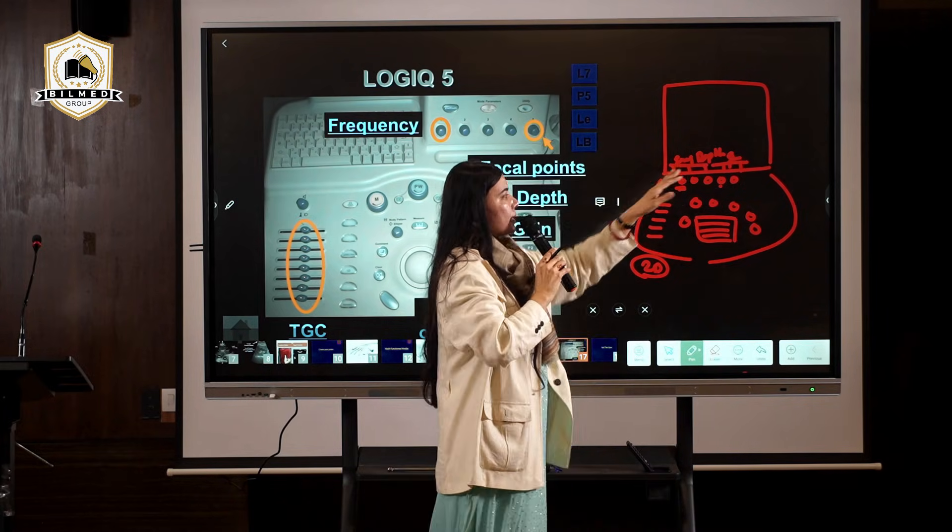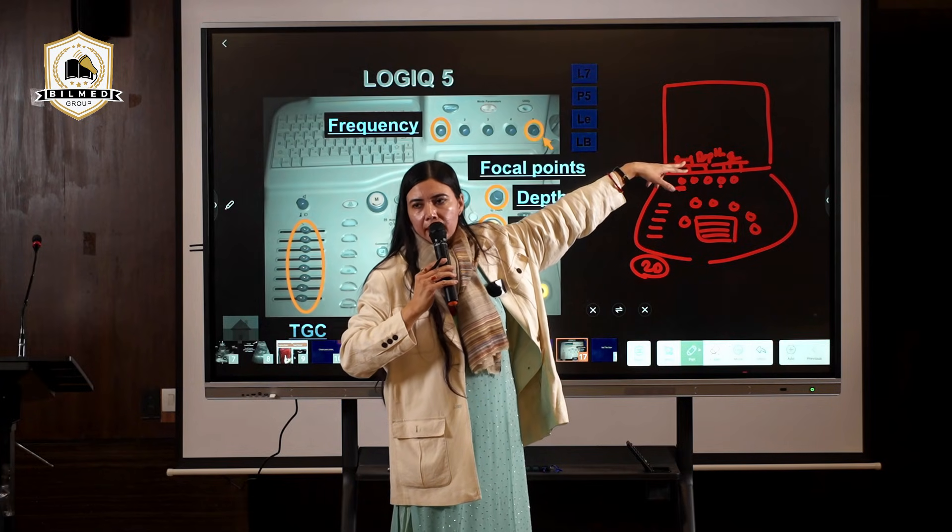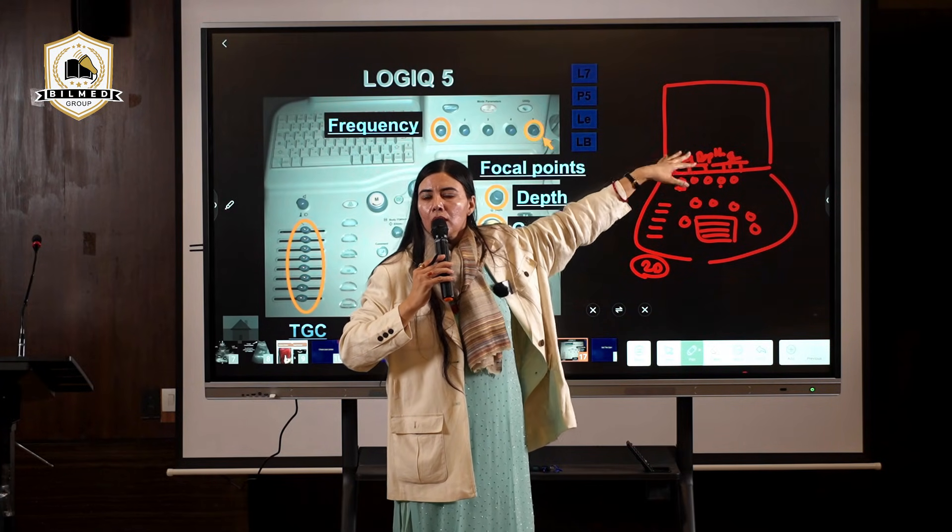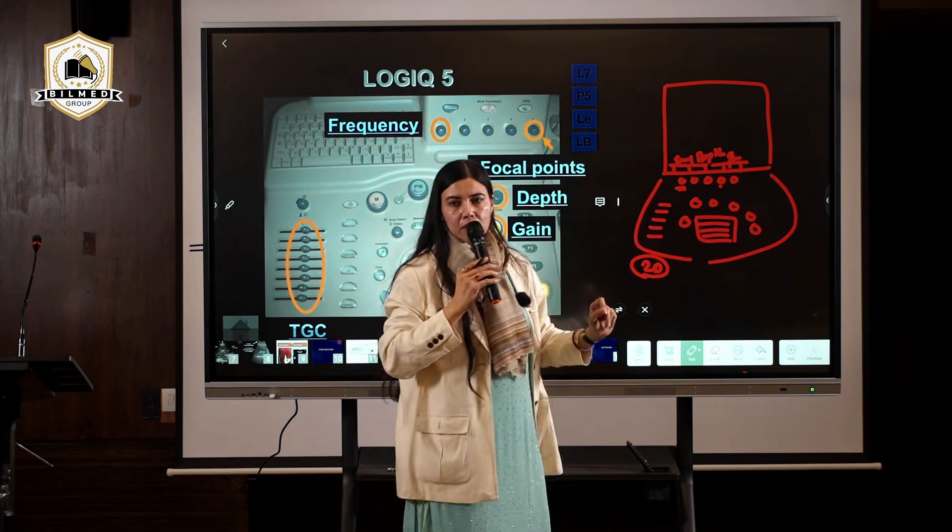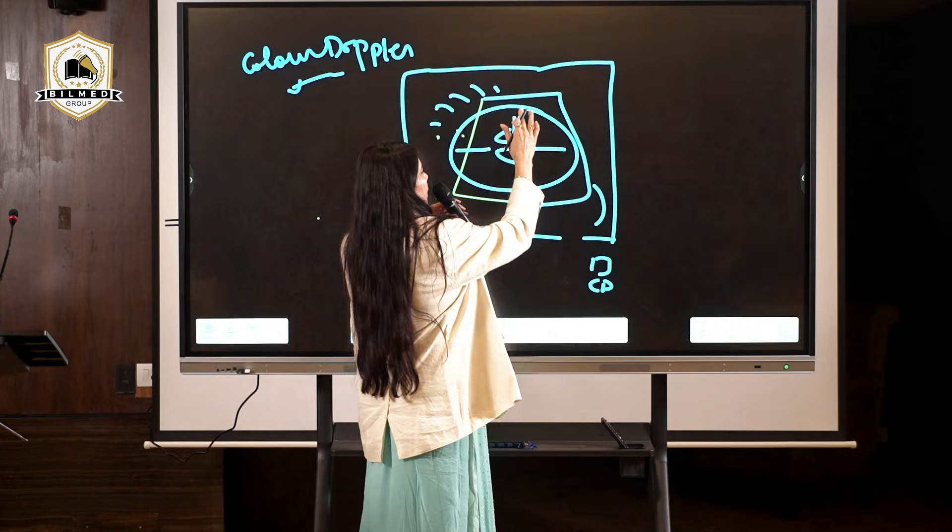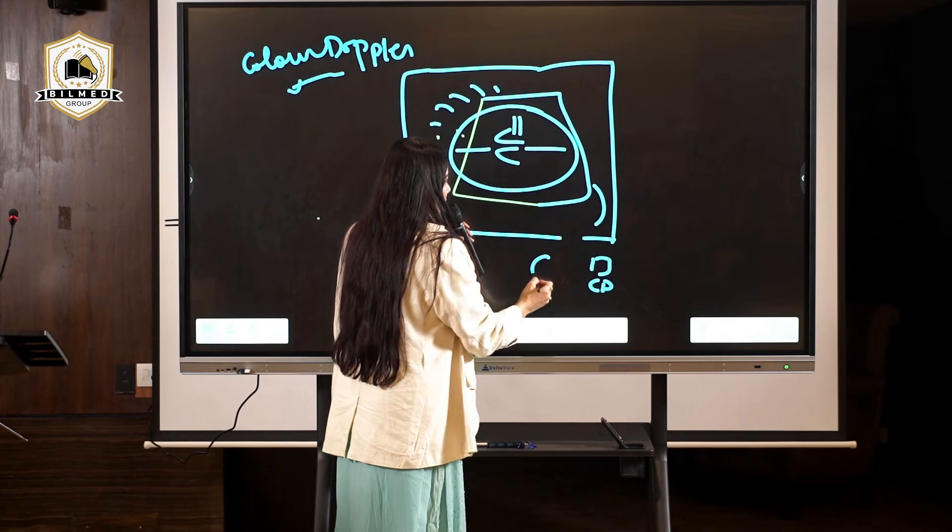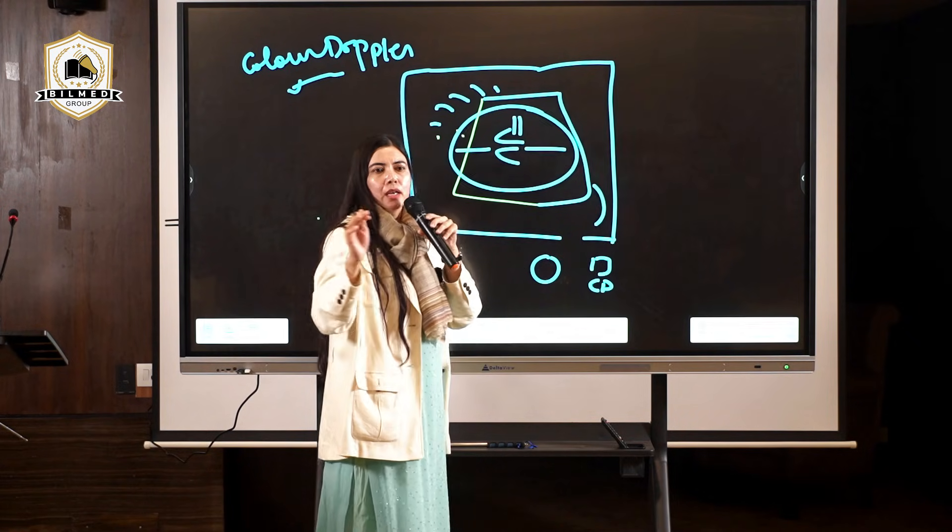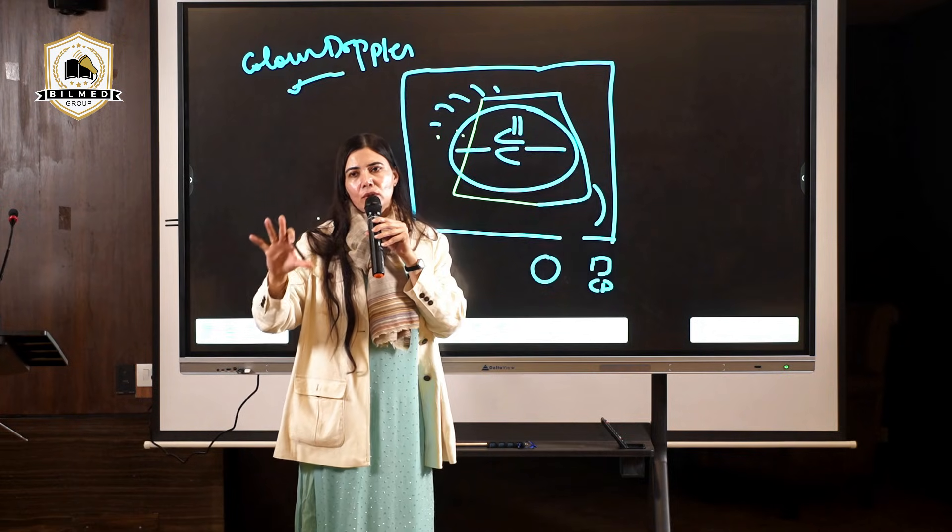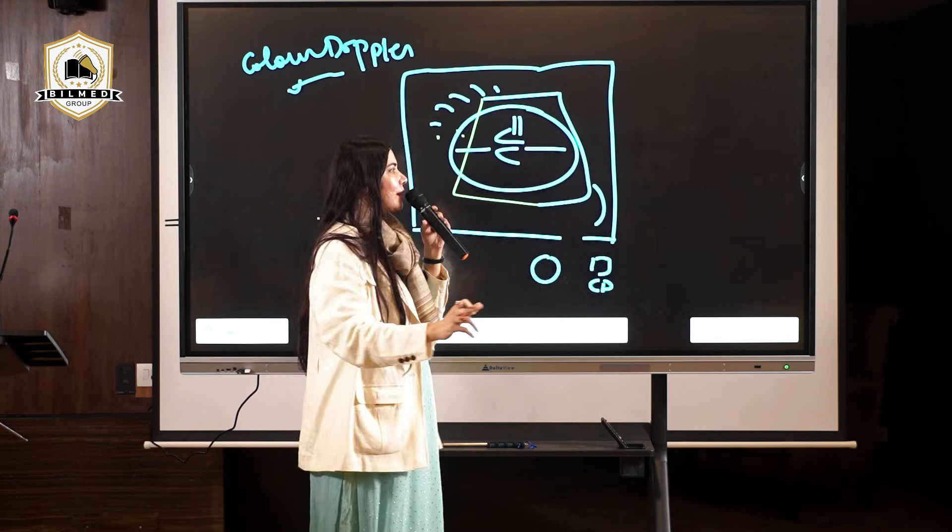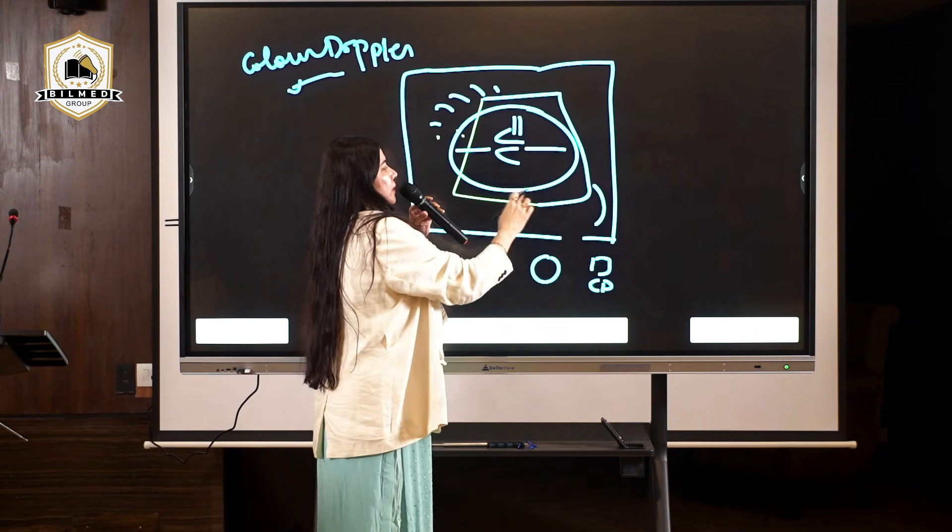This is 2D scan. Now I am switching on to color mode. I have pressed the color button here. Now the color box is there. I can increase or decrease it by rotating the mouse. Your engineer is going to tell you how to increase or decrease the size of this box. First important thing is always keep a check on the size of this box.